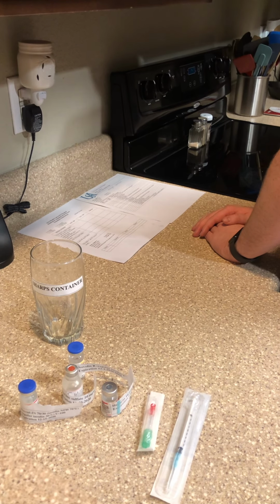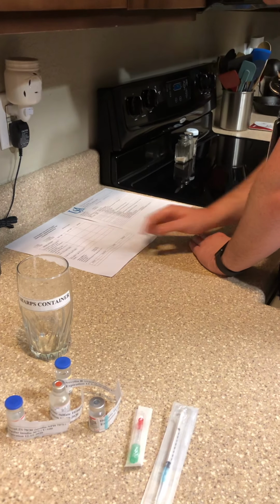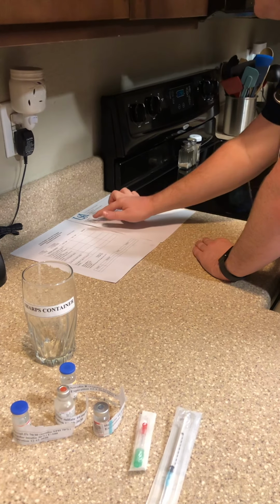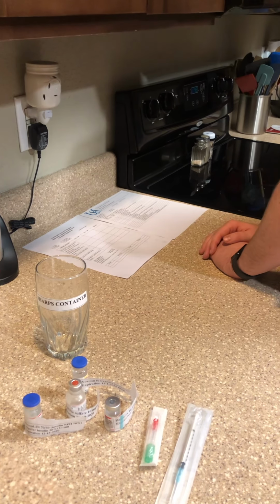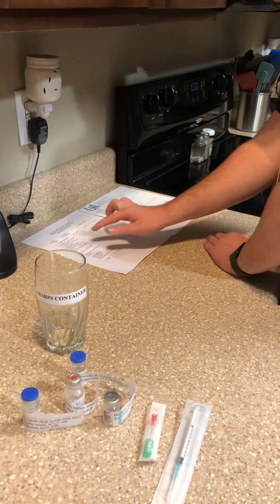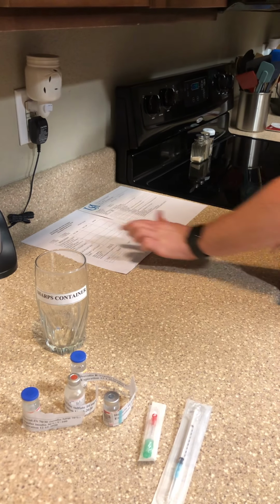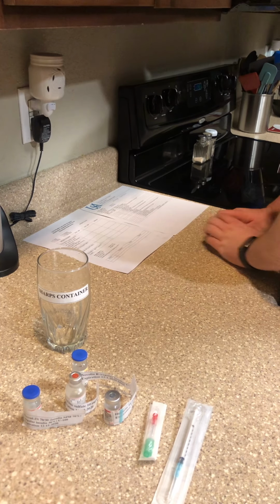Now I'm going to verify the 5 rights. The right patient is Jaguar J. Jones. The medical record number is 417-6352. The right drug is heparin. The right dosage is 5,000 units. The right route is subcutaneously, and the right time is every 12 hours.